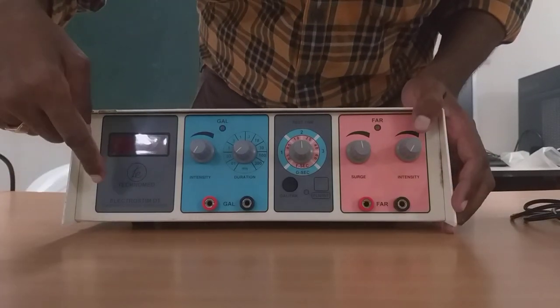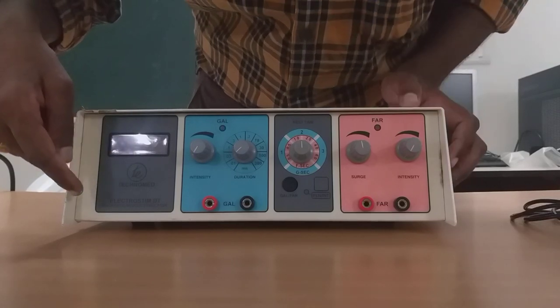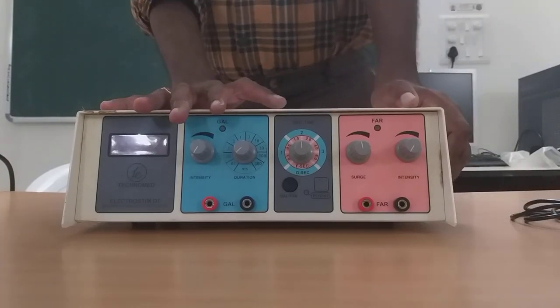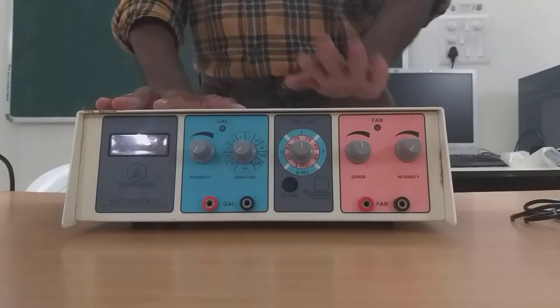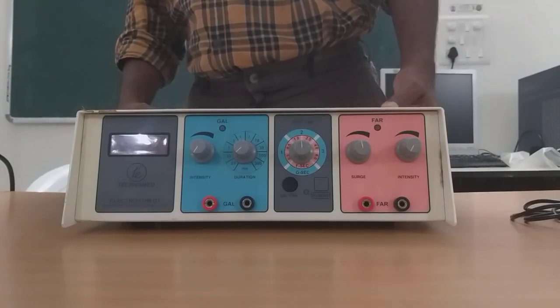You can see it has written as Electrostim DT. DT stands for diagnostic. This is not a therapeutic stimulator actually. I will tell you why this is not a therapeutic stimulator at the end. So this is a diagnostic stimulator, but we are using it right now for therapy also.